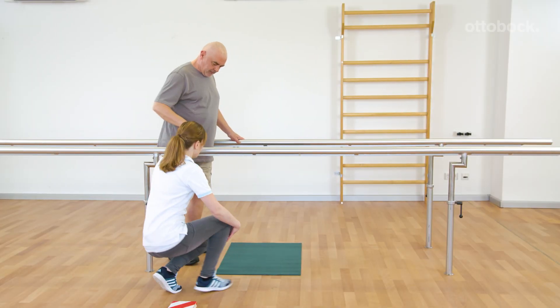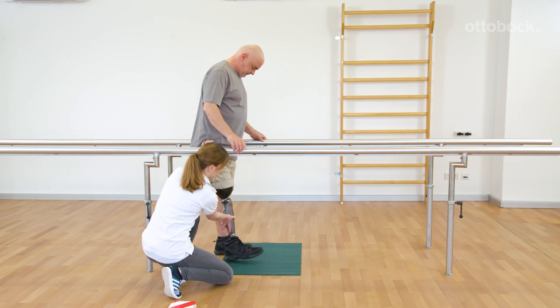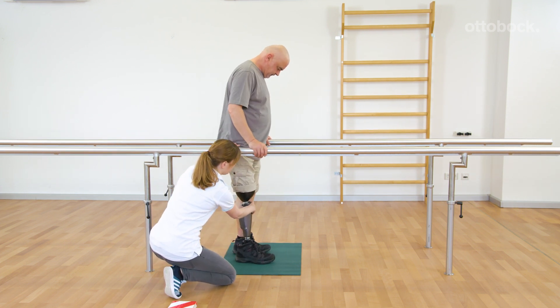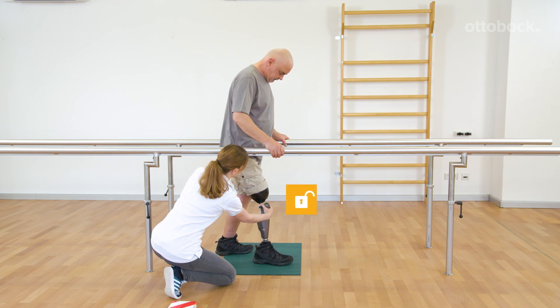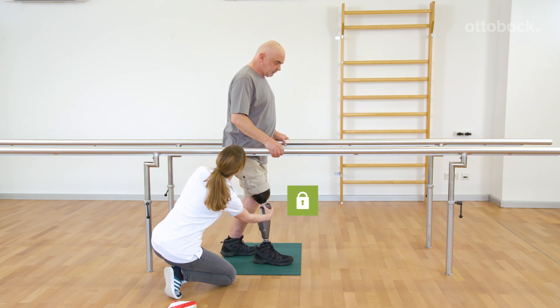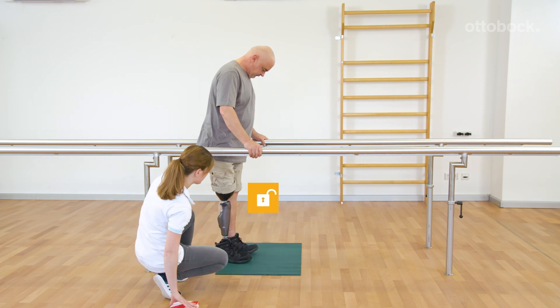Franziska shows how the intuitive stance function is activated. If the knee joint is slightly loaded in a bent position and not moving, it will be locked against flexion. The easiest way to simulate this is to place the prosthetic foot in front while on level ground.